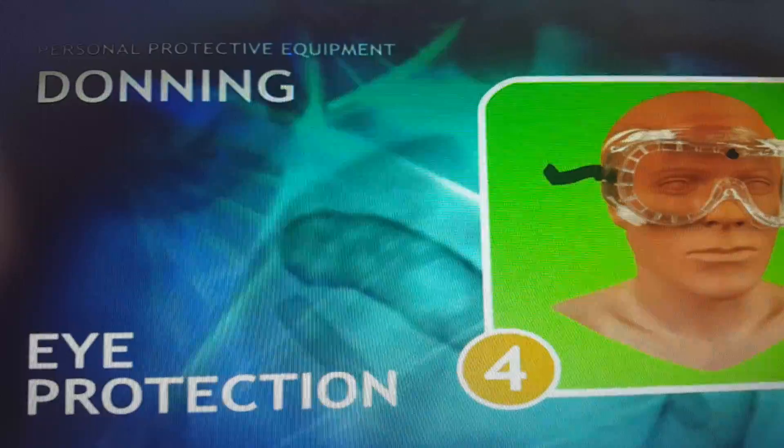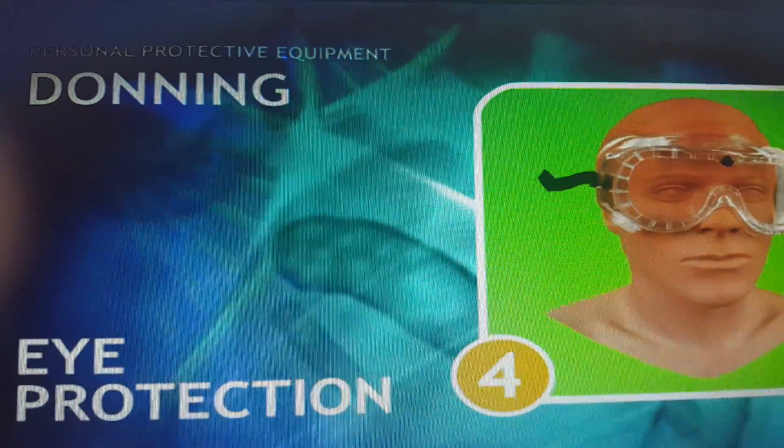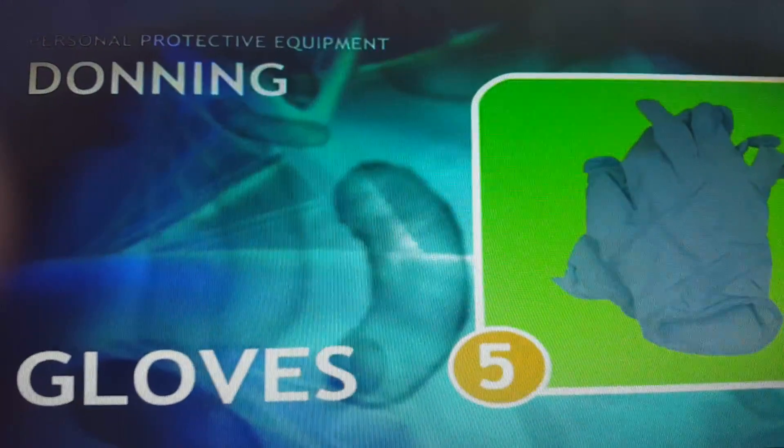Number four is eye goggles — this is eye protection. Number five is gloves.